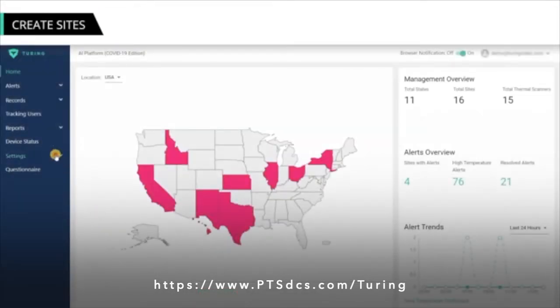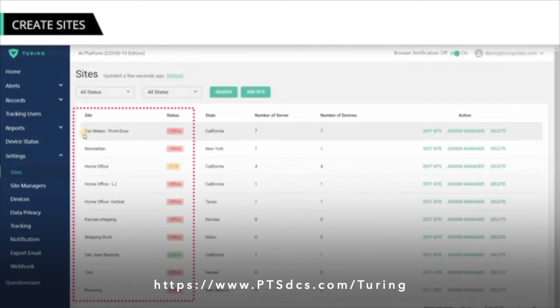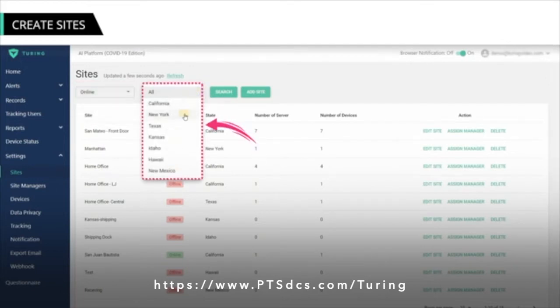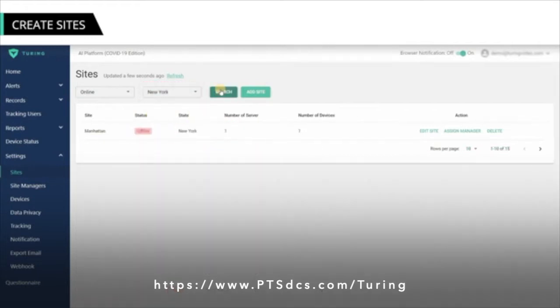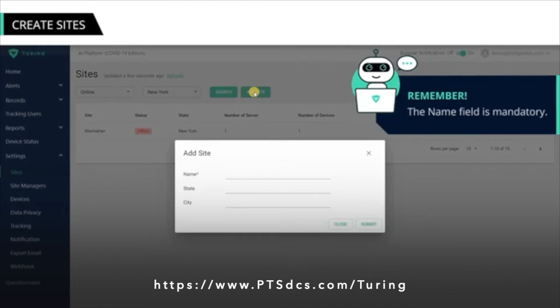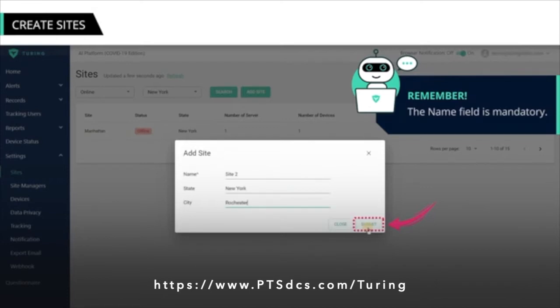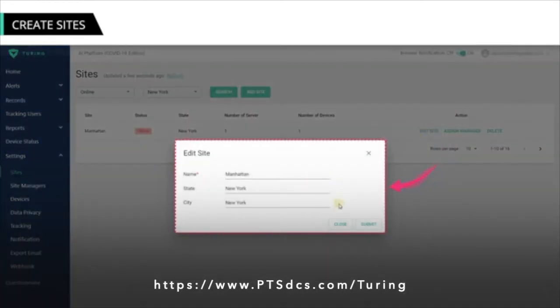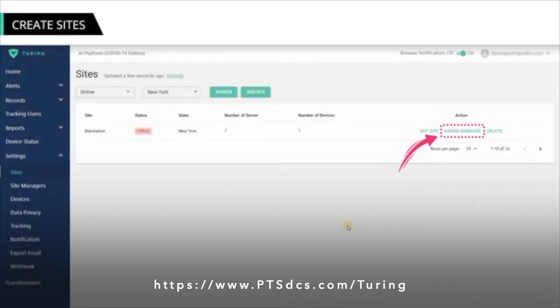You can access the Sites page from the Sites menu under Settings. The Settings Sites page allows you to view all your sites and whether the scanners show online or offline status. You can monitor all the states that have scanners operationalized, and use filters to view the status for a specific state. To add a new site, click Add Site. On the Add Site overlay box, provide the site name, state, and city, then click Submit to save your new site. The newly added site will appear on the Sites page, where you can also edit site information, assign a manager to a site, or delete a site.